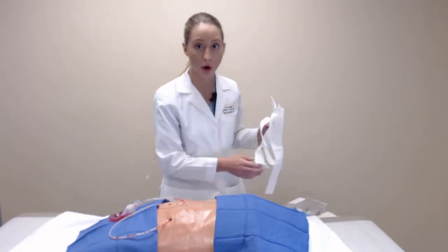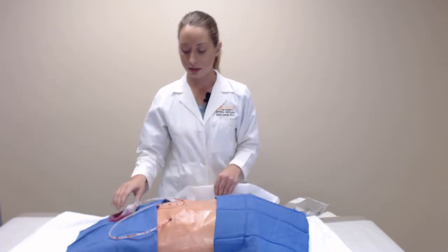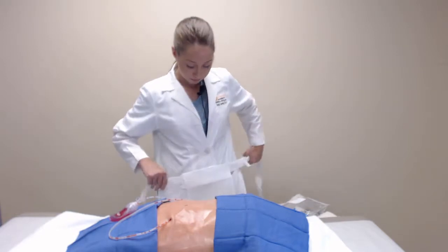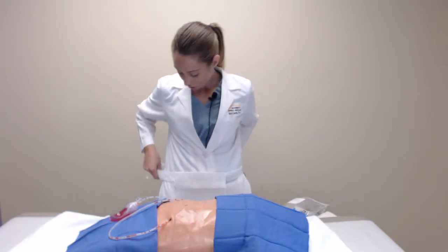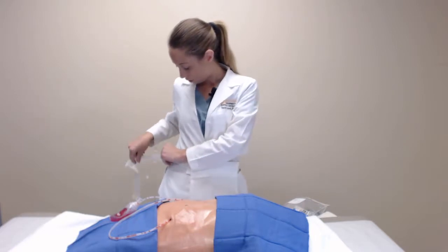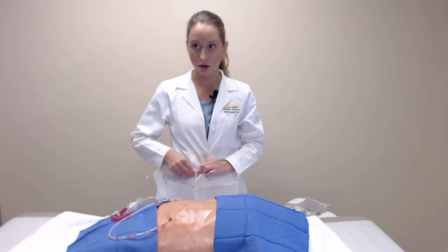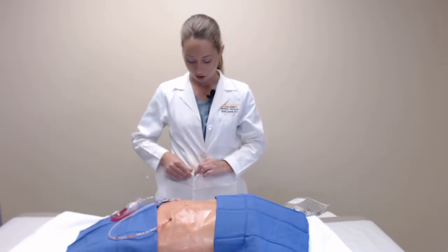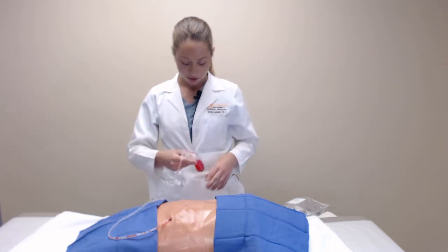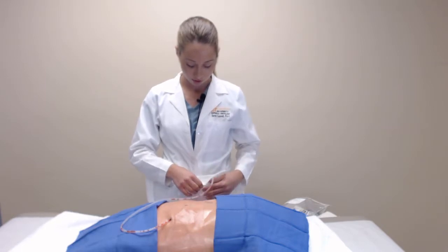The first component we'll go over is the waist belt. The waist belt is important so that your drain does not hang without support. To put on your waist belt, you wrap it around and you secure it using the Velcro. If you have belt loops, you can also have added security by securing it to your belt loops. The pocket here is designed to drop your drain bulb in and secure with the Velcro.